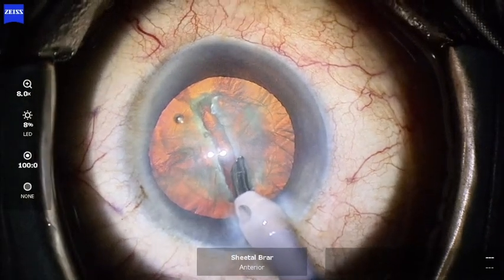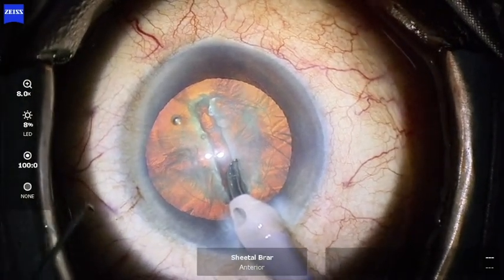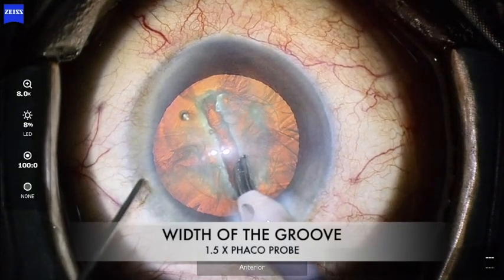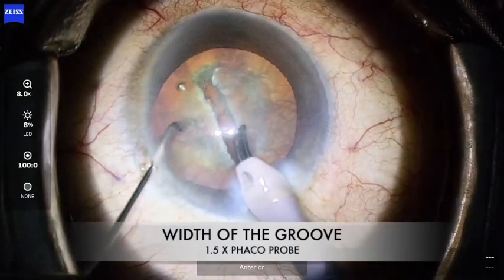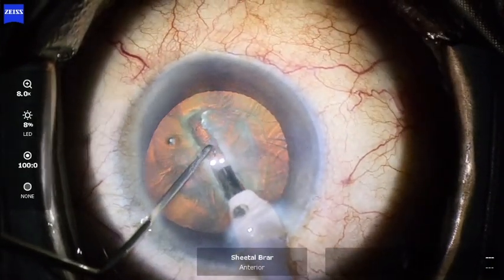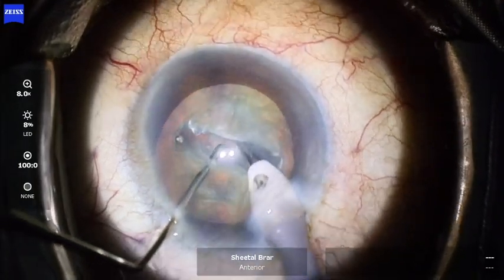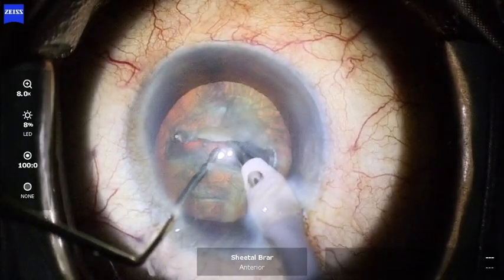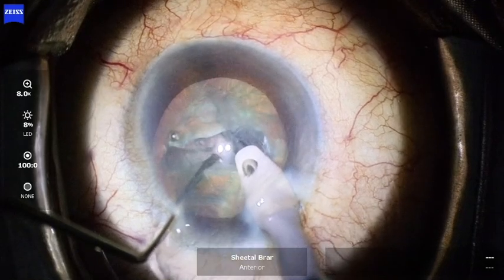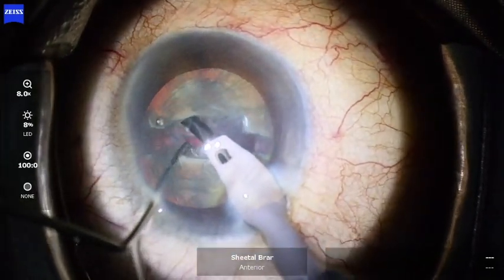It is also important that the walls of the groove are structured well and not damaged or made wider by more than one and a half times the width of the phaco probe. Once these are ensured, one can place the chopper and phaco tip deep inside the groove along the sides of its walls and apply a gentle lateral force to crack the nucleus into two halves.